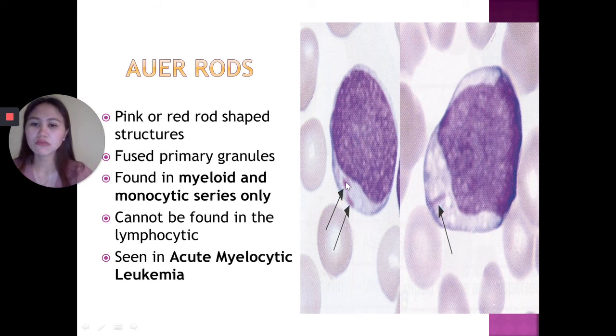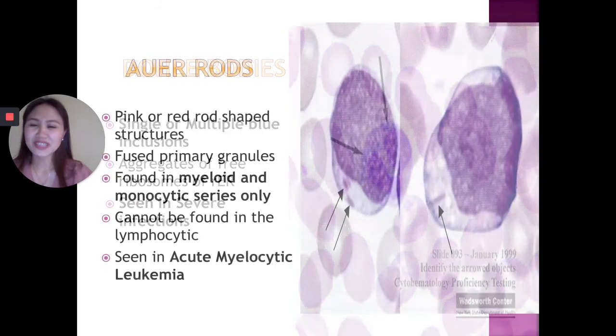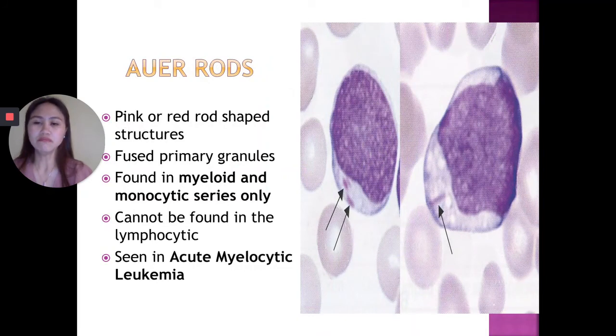So this is usually found in patients with acute myelocytic leukemia, but cannot be found in lymphocytic leukemia. Only for myelocytic and monocytic leukemia.